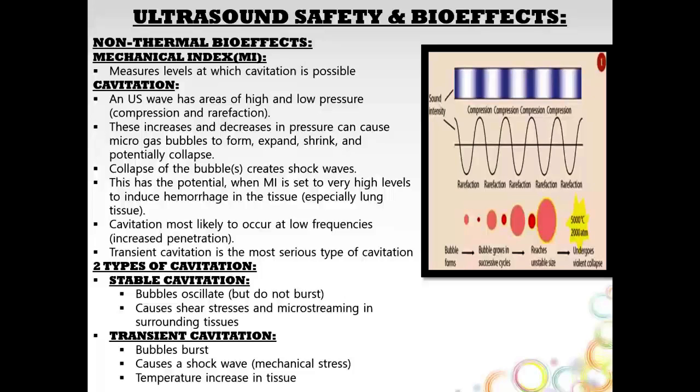Cavitation is most likely to occur at low frequencies, where you're using increased penetration. The most serious type of cavitation is transient cavitation. So there's two types, stable cavitation and transient cavitation.